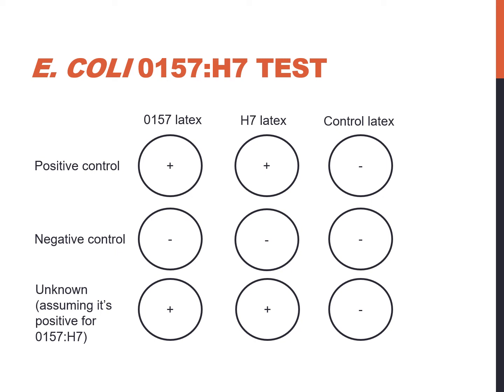So that's it. That concludes Unit 18, where we discussed our miscellaneous gastrointestinal pathogens and methods for identifying certain things like Yersinia enterocolitica, Vibrio cholerae, Vibrio parahaemolyticus, and other organisms such as Clostridioides difficile, Campylobacter, Aeromonas, and that's about it, and a little bit about serotyping Salmonellas and Shigellas. So stay tuned for Unit 19.